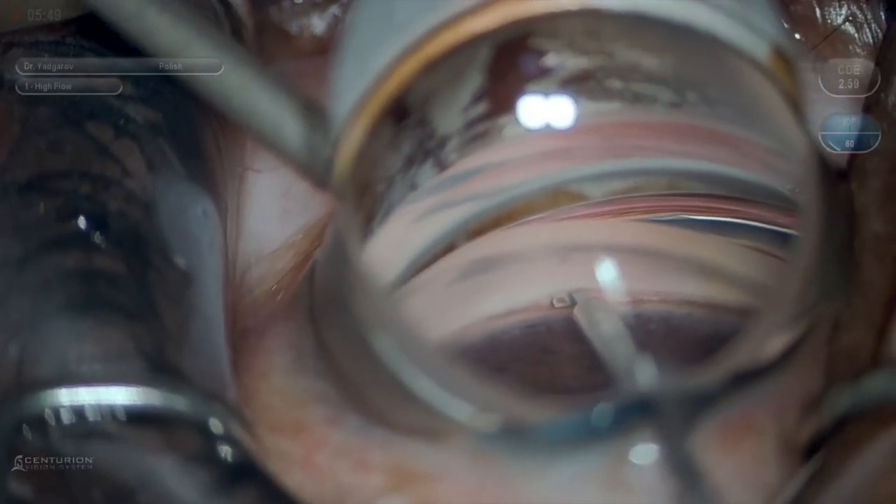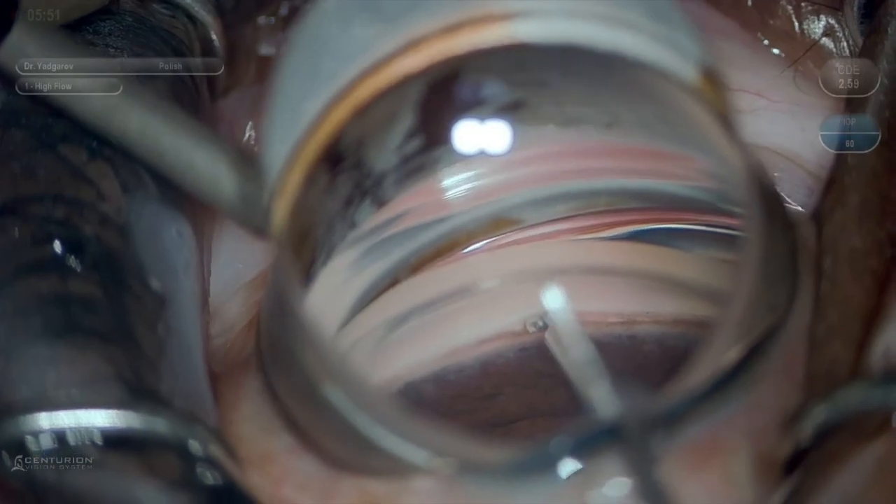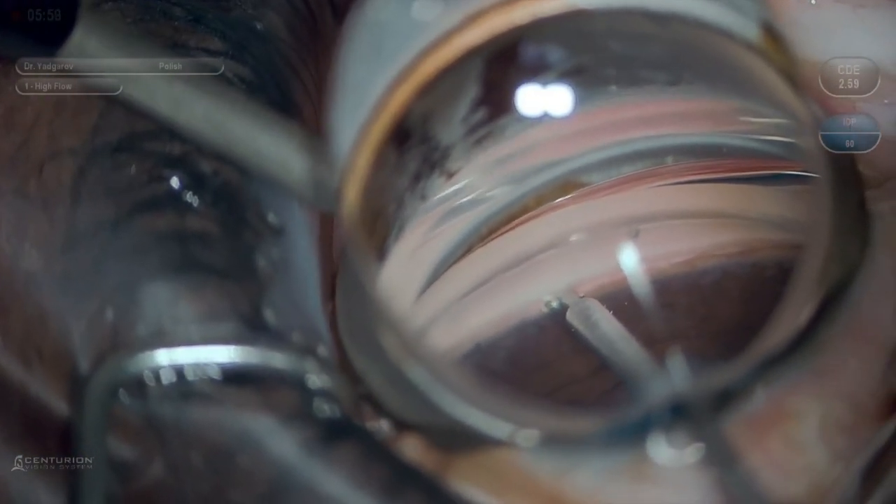Take a look at this window and you may see some motion within it. This is where the stripped trabecular meshwork is accumulating within that trap. I am feeling no resistance and not getting caught or stuck anywhere, likely due to the tip being blunt.